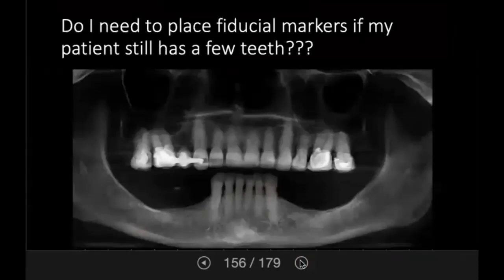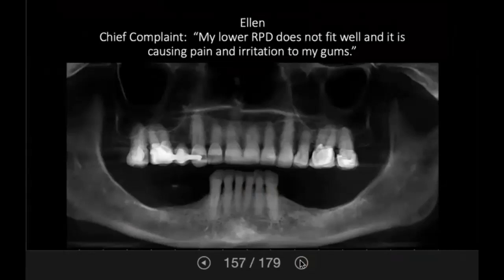Do we need fiducial markers if we have some teeth? This is Ellen. Ellen has a chief complaint that her lower partial does not fit very well and it's causing pain and irritation to her gums. Her anterior teeth are in great condition and do not need to be extracted.